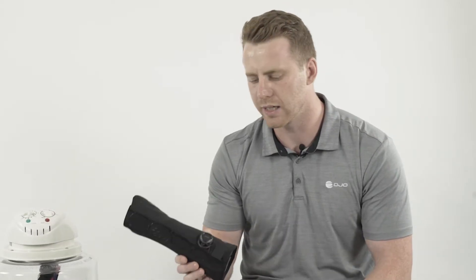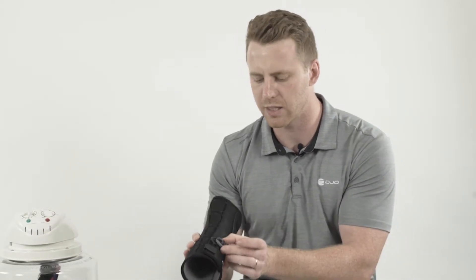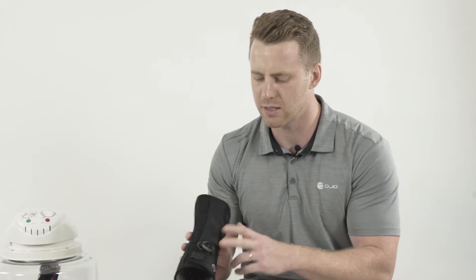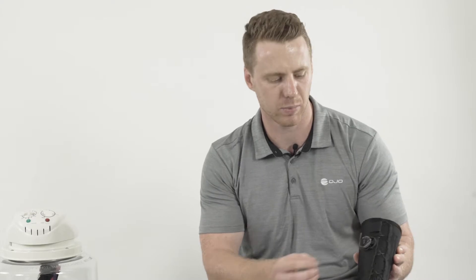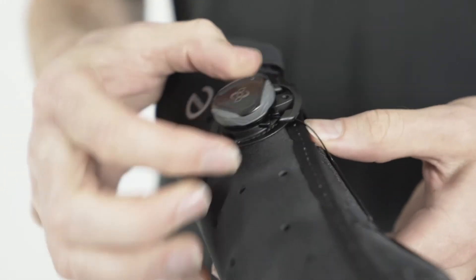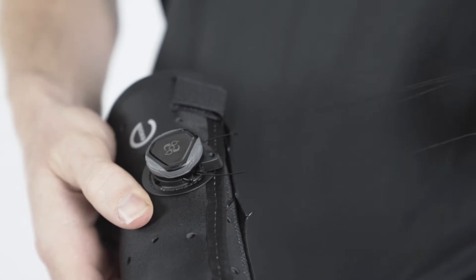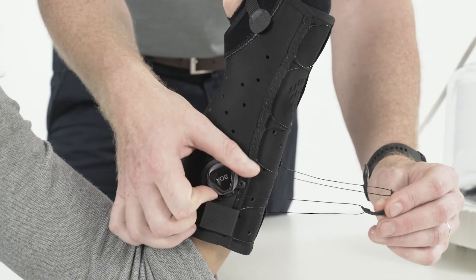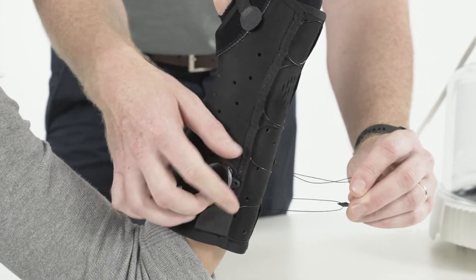In terms of tightening and applying the brace, the most important and unique feature is the BOA retention system. You may have seen these on products like golf shoes and cycling shoes — DJO has the license to use them on our rigid braces. To loosen the splint, pop the BOA system off and pull the tab. To tighten, push the BOA down and tighten it to a level that's comfortable for your patient.